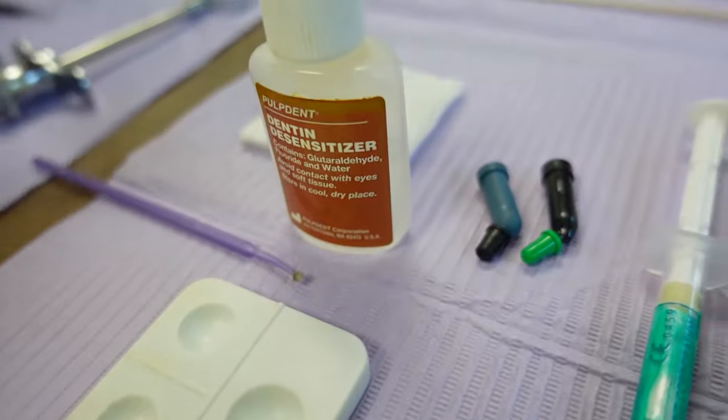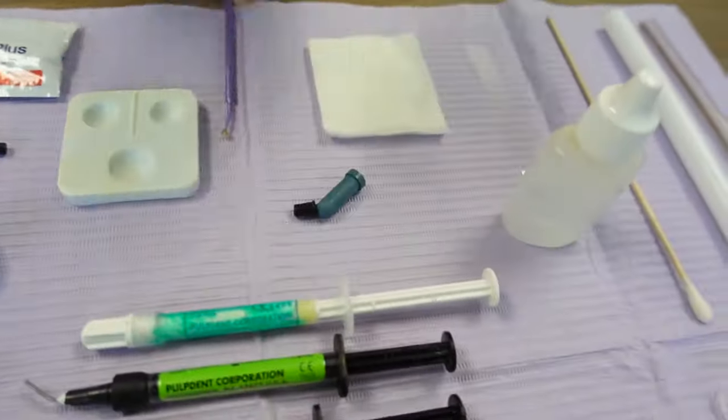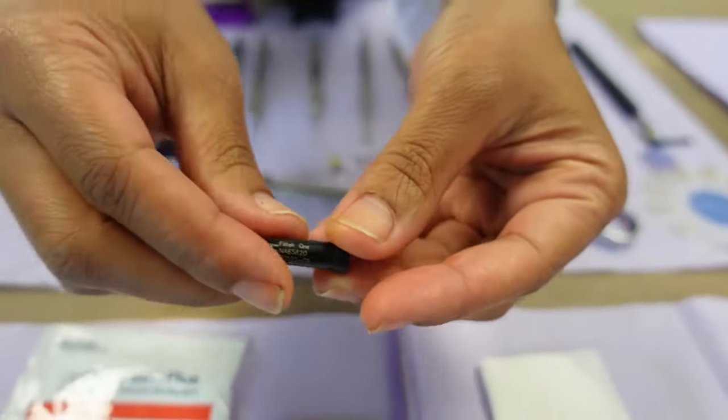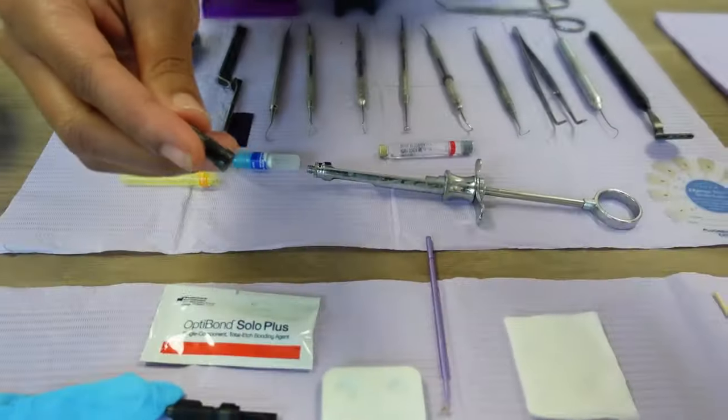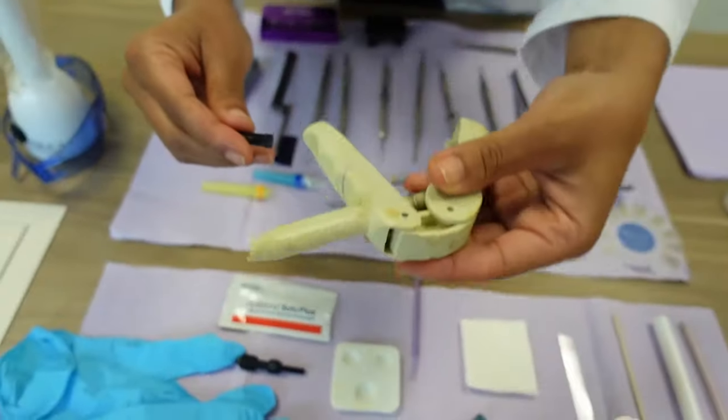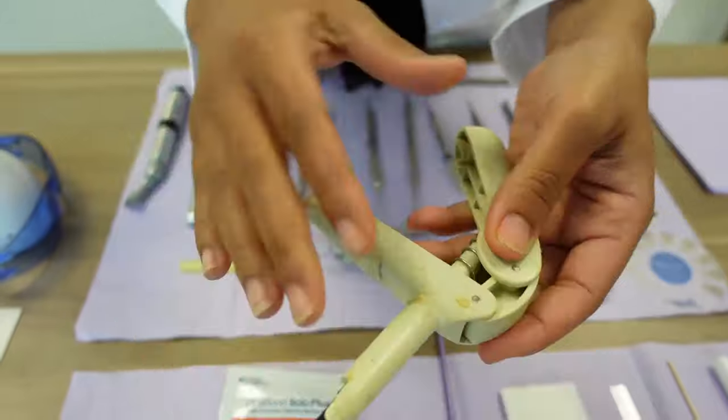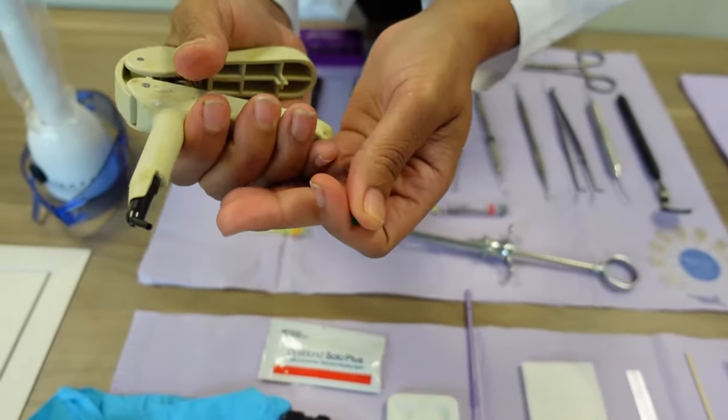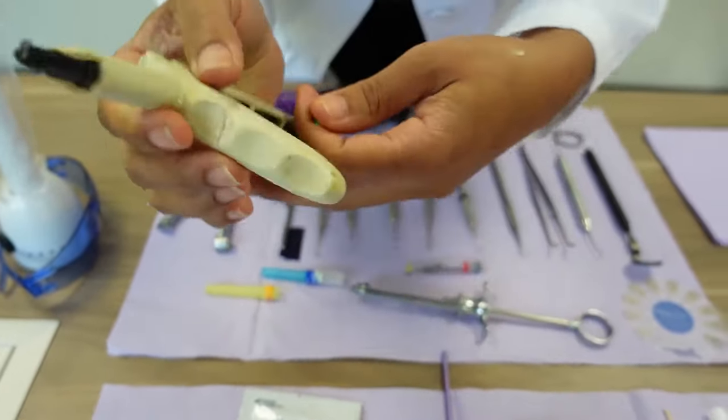This is actually a composite capsule—of course it says B1 because there are different shades of composite. Now I'm going to bring this over here, which is a composite gun. I'm going to snap it in. That's how you put it in. You take the cap off, press it a little bit just to get a little bit out because the doctor likes to test it. Hand it to the doctor so it comes out smoothly.